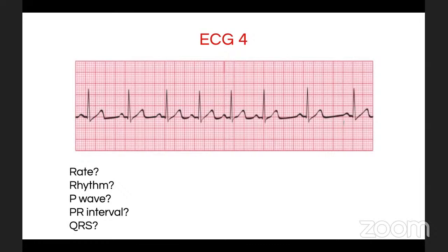يلا مين يقدر يساعدني؟ 6 second step ممتاز. 6 second step هي الطريقة الأفضل. طيب كيف نحسبها؟ يلا مين يحسب لي إياها؟ ممتاز. قلنا نشوف by cycles. هذه 1 cycle، second cycle 2 3 4 5 6 7 نضربها ب10 ممتاز شكرا ناد. طيب so 7 by 10 okay equals 70 beats per minute.